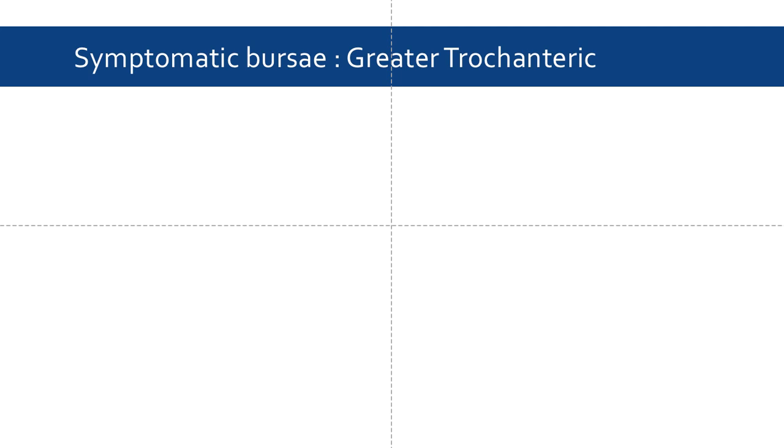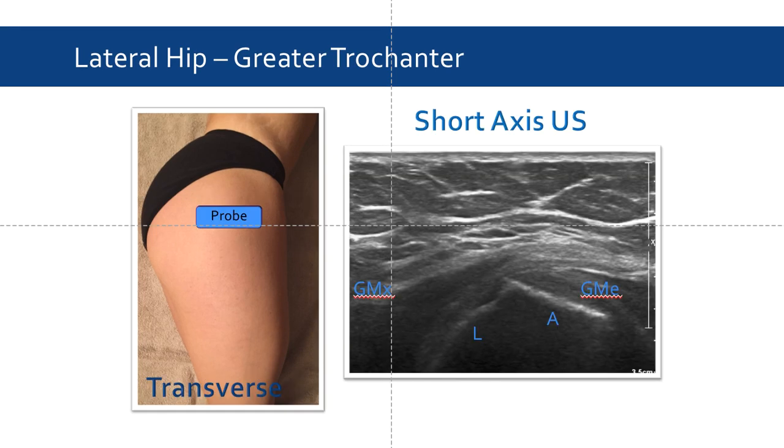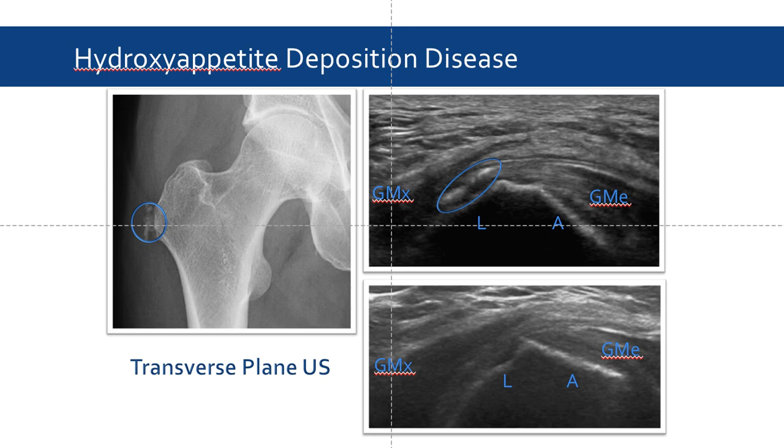Now we're going to focus and revisit the greater trochanter. It's also possible to visualize the greater trochanter transversely by rotating the probe 90 degrees. This probe position gives us an ideal view for assessing the greater trochanter's anterior and lateral aspects, and it's also possible to make out the gluteus maximus and gluteus medius muscles. For example, we can identify calcium phosphate crystal deposition in the periarticular tissue of patients with hydroxyapatite deposition disease. We can see the hyperechoic crystals deposited on the tendinous insertion of the gluteus medius, circled in blue.